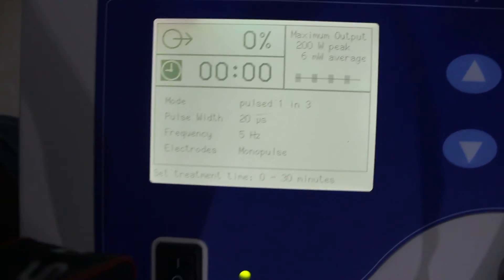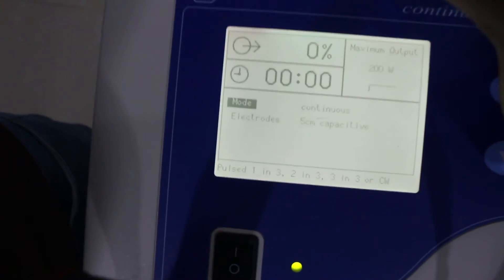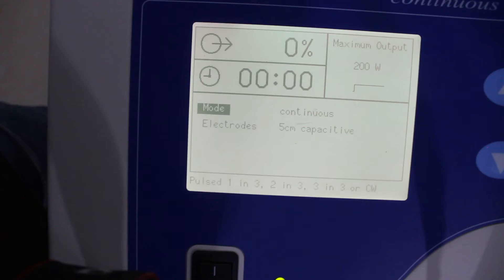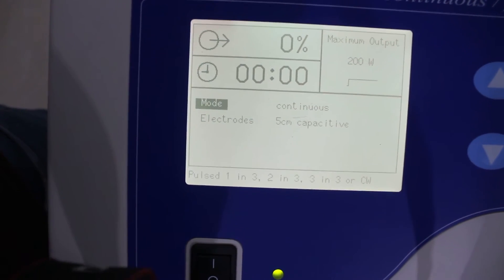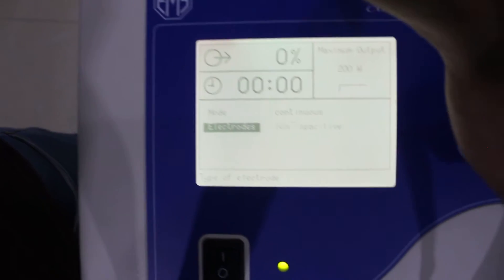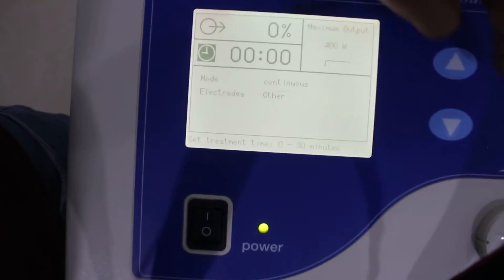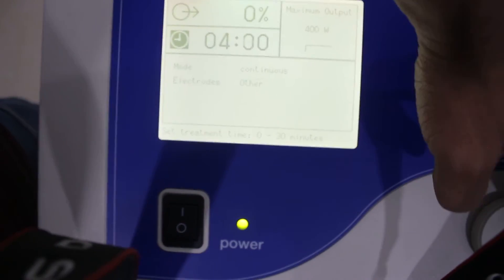or continuous. You can see here that it is currently set to continuous. Then we need to set the electrodes — in this case we need to select two. And here is the treatment time; we can set it to, let's say, 10 minutes.